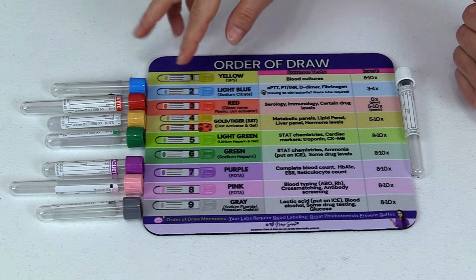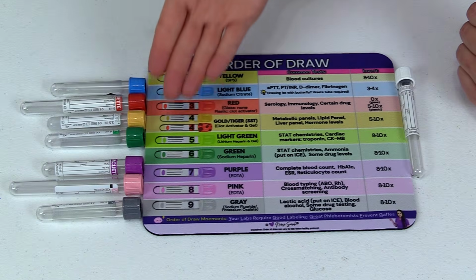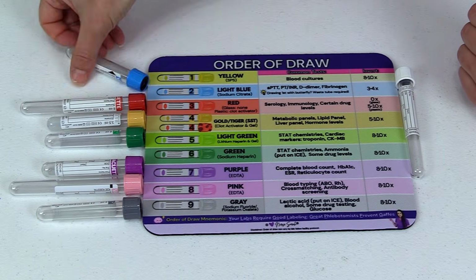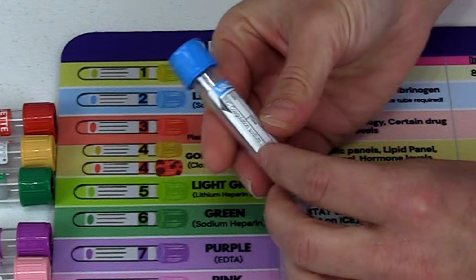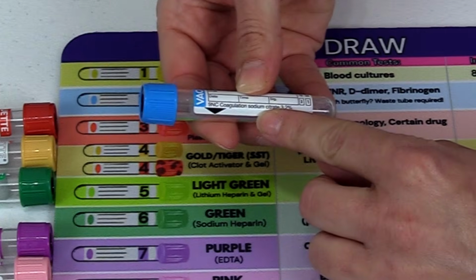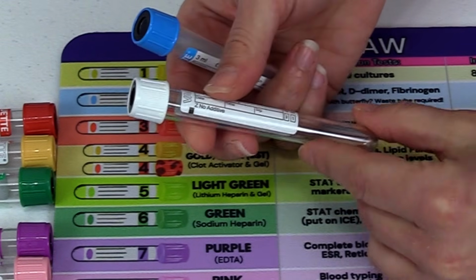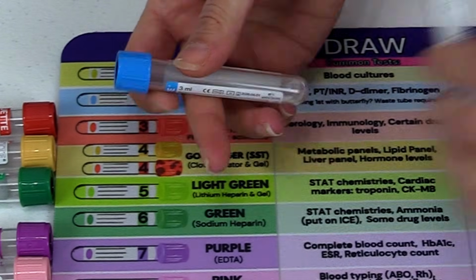So let me quickly go over the anatomy of a lab tube. So your lab tubes are going to have different colored tops, and on the tube, if you take a peek at it, you're going to see, here I'm using Vacuette tubes, what kind of additive this tube may have. Not all tubes have that, like this one is sodium citrate. And like this one is a white, it says no additive. Now, a lot of times white is going to be used as a waste tube.